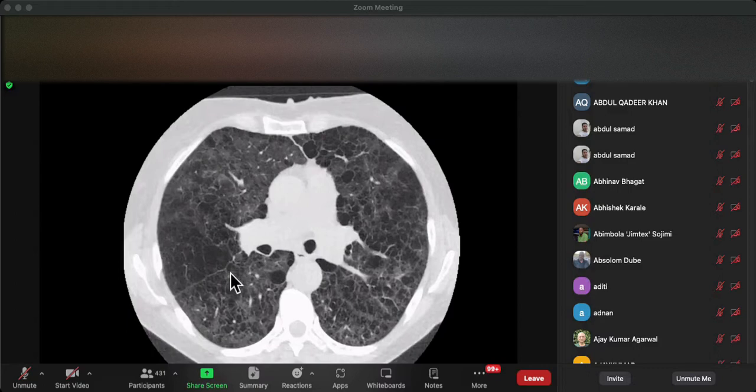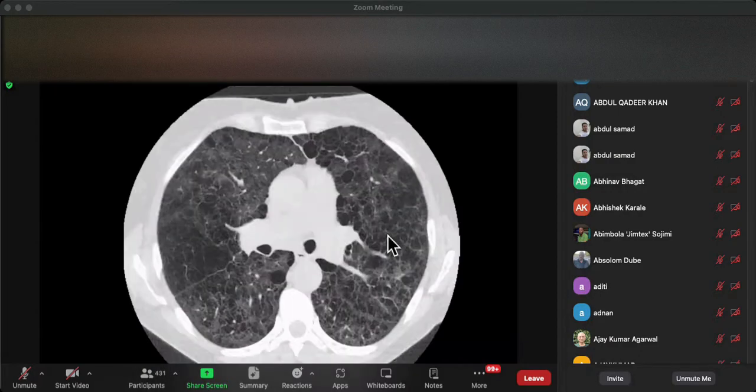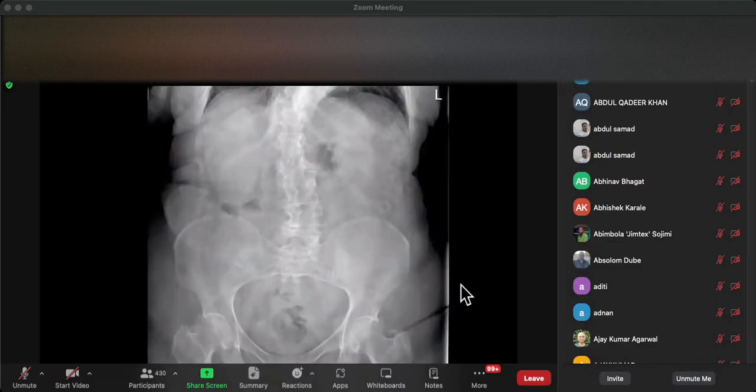So looking at the chest X-ray, you can see the neurofibroma here. And so the cystic lung disease is associated with neurofibromatosis. And the patient also happens to be a smoker, which is contributing to the volume expansion. So some of these are cysts and some of these are areas of emphysema. Another patient who's got neurofibromatosis. So we've got lots of neurofibromas just here. A bit more challenging to see, but do look for neurofibromas in the exam.